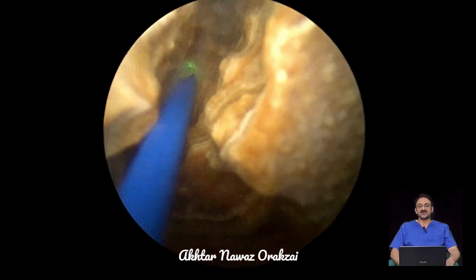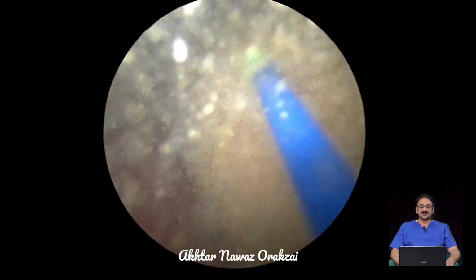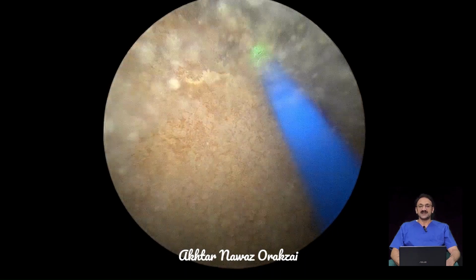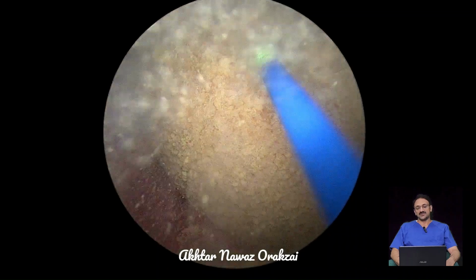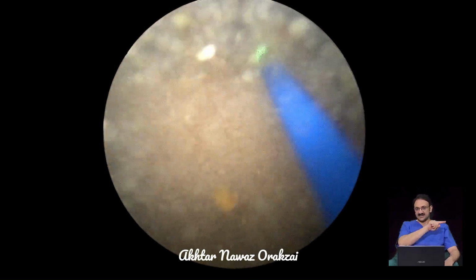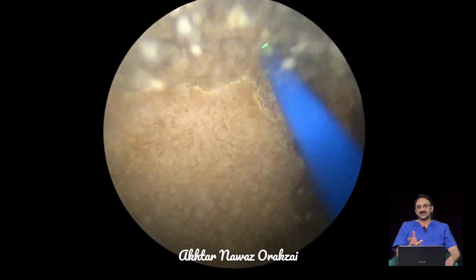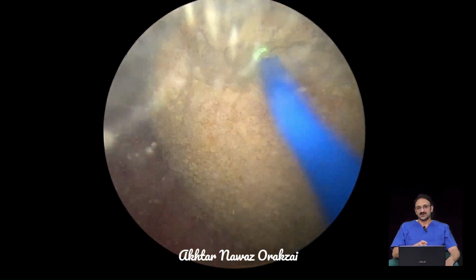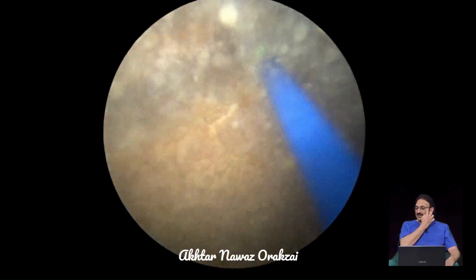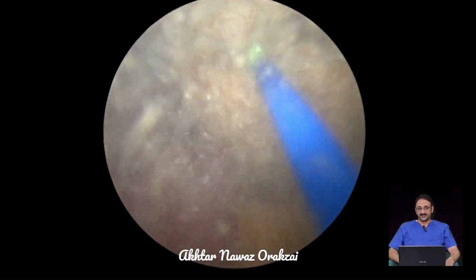Here you can see that we are drawing a line and dividing the stone into 2 pieces by using the laser fiber. One line has been drawn, and now we are drawing another line across, one in this direction and the other in this direction, and then we will rotate the stone and expose the opposite, contralateral surface of the stone, so that we can draw a line into that as well.